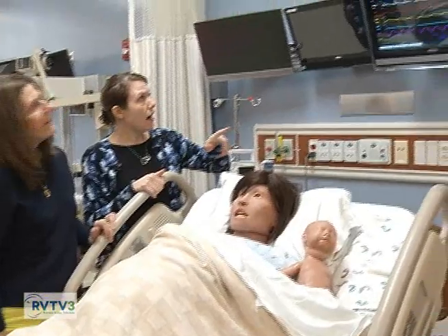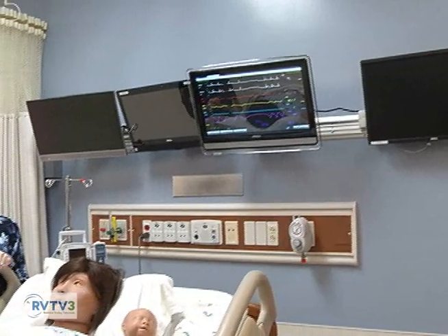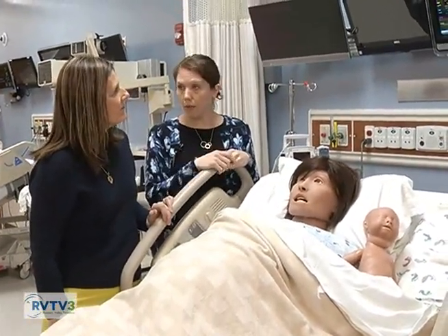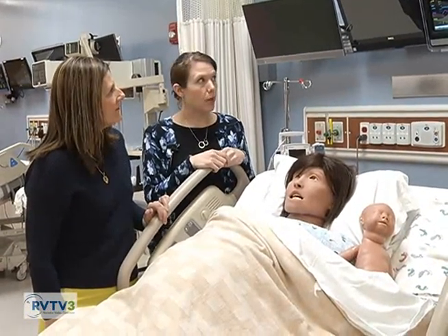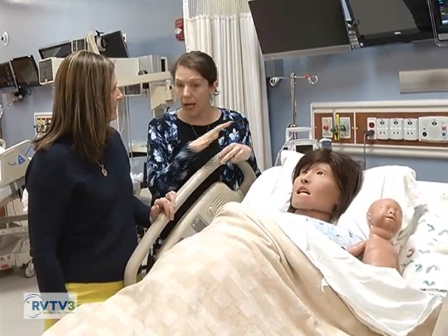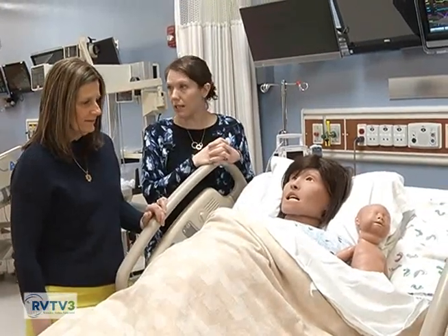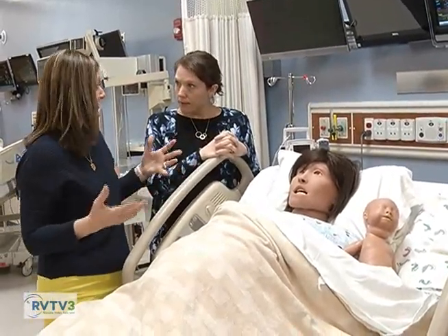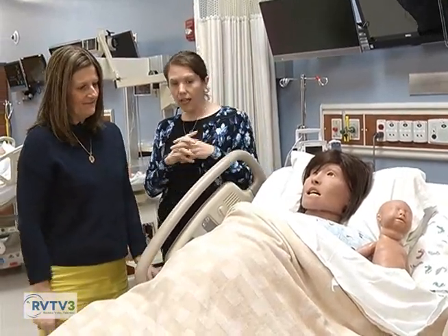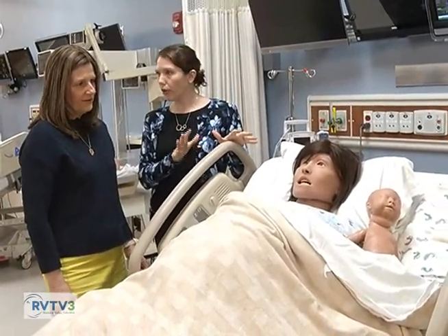Up here you'll see on the monitor her standing vitals. We can change those at any time if we need to help facilitate the scenario or to replicate what's actually happening with a patient's physiology in this type of situation. She weighs similar to what a normal patient would weigh. So if we have to move her, we're replicating that experience as well. So she can do several kinds of deliveries as a human. That's exactly right. Very impressive, an extraordinary piece of technology here. Really amazing tool for our learners.